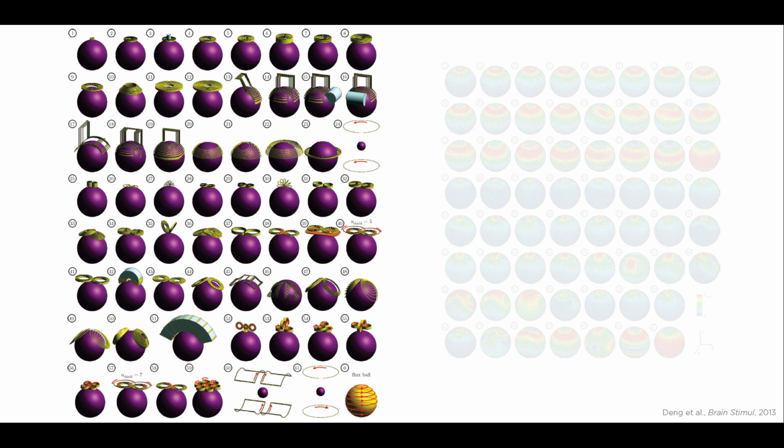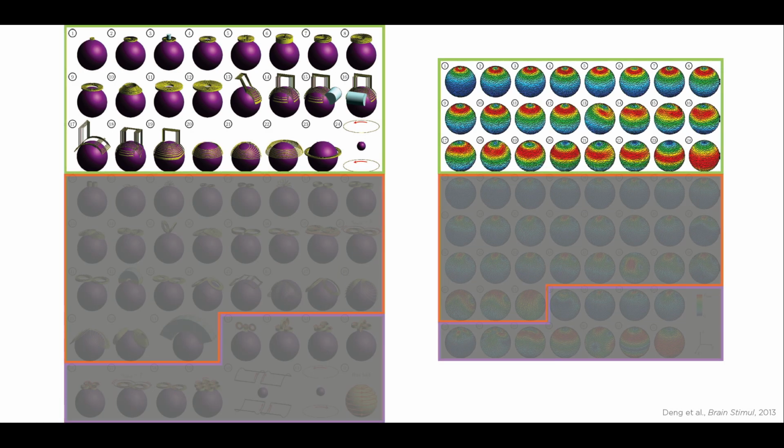And you can see here that TMS coils come in various sizes, from a very small circular coil to a very large helmet-type coil. And the same applies to figure-8 type designs. They come in various sizes and shapes as well. So the 3 categories are, number 1, circular type coils. These coils consist of a circular loop of winding, or stacks of circular loops, which produces a circular field pattern underneath the perimeter of the coil.